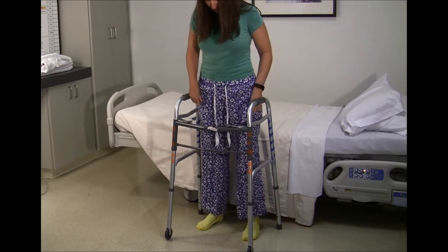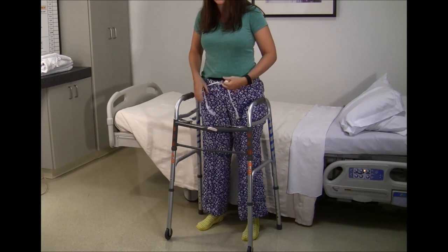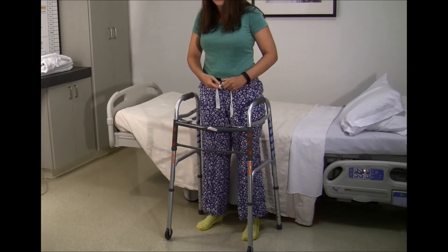A helpful tip: to conserve energy, it is often helpful to put on underwear and pants both while sitting down in the chair, and then stand one time to pull up both.